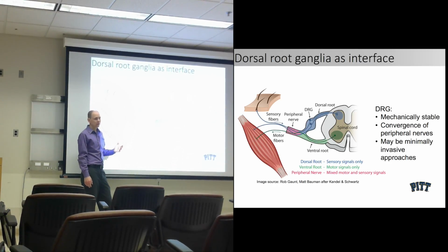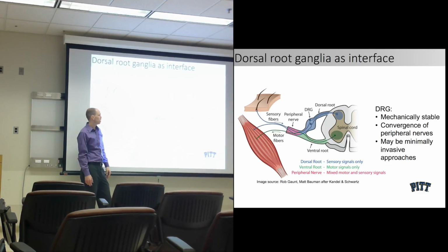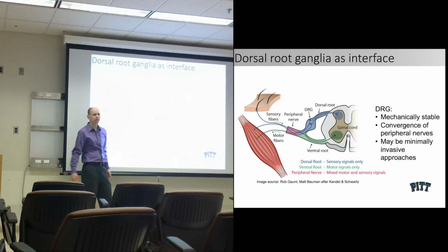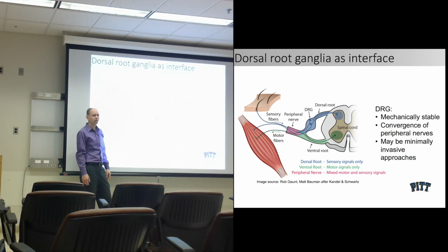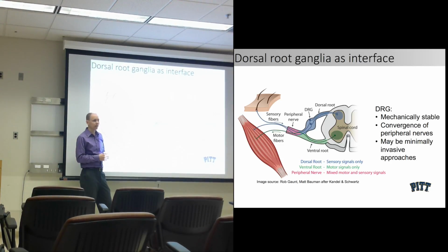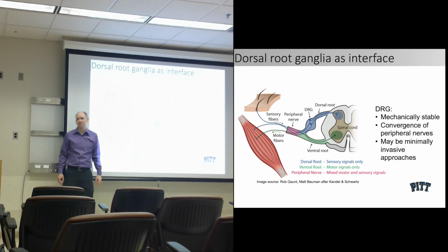So one example is that when we're doing functional electrical stimulation for locomotion, we did a study where we could decode the state of the limb based on recordings from the dorsal root ganglia. So a nice benefit of the DRG is that it's relatively stable, at least compared to peripheral nerves that are all moving and perhaps sliding around the muscle in the limb, and which may have multiple nerves converging together at individual levels. And there may be some minimally invasive approaches to accessing the roots. For example, there's one company recently that has an electrode that stimulates dorsal roots for pain control, spinal modulation, through a percutaneous implant. I hypothesized maybe we can get to a point where we can finally get some similar types of interface with the DRG.